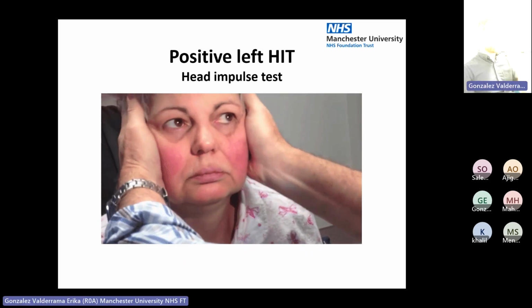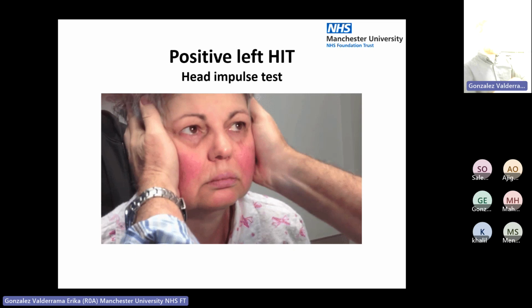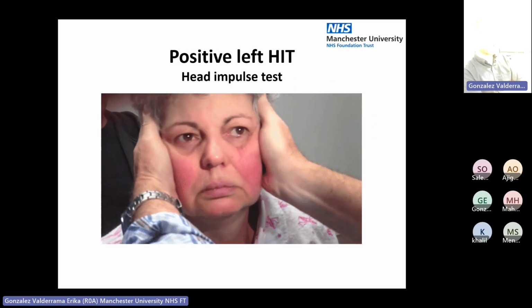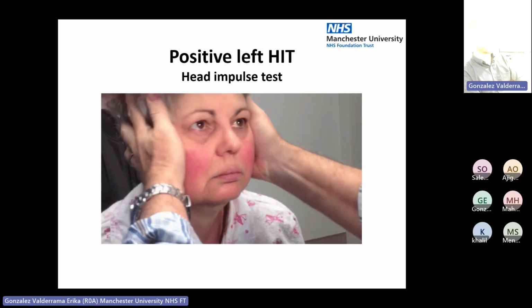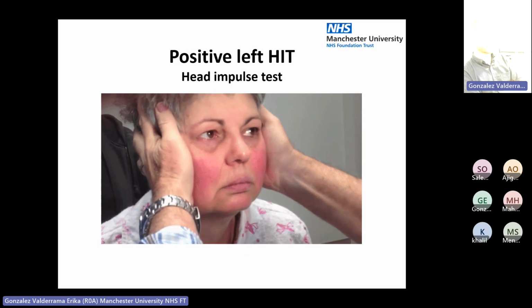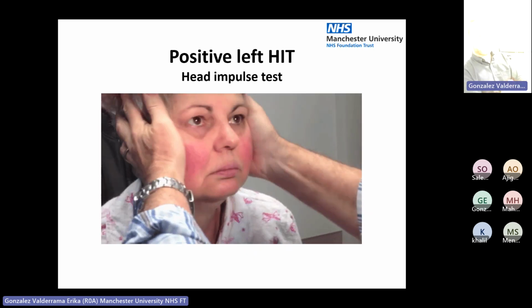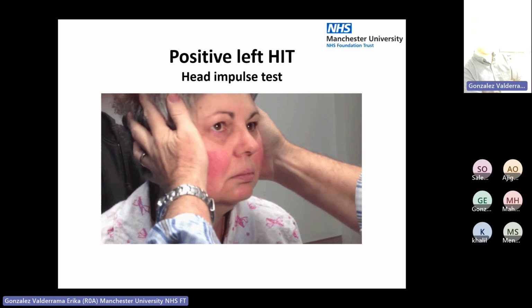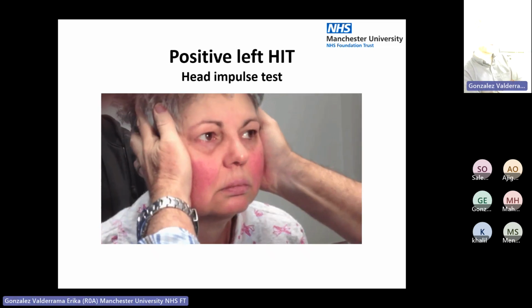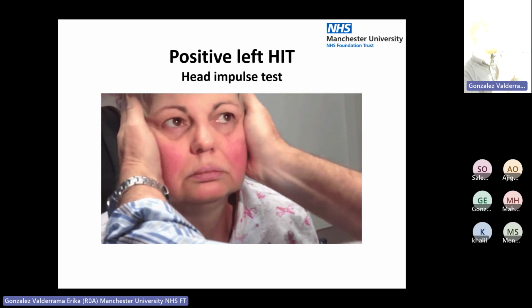Now it's tricky in older people because they don't always look directly at your nose. They're often flicking their eyes about, and they're often getting distracted, and people get anxious when there's somebody that close to them, so they move their eyes around a lot. And if this person is dizzy on a ward, this is going to make them feel pretty dizzy.